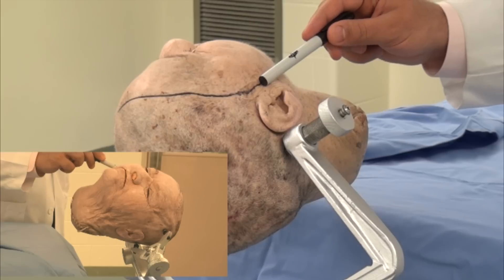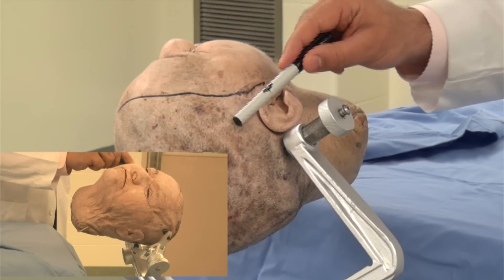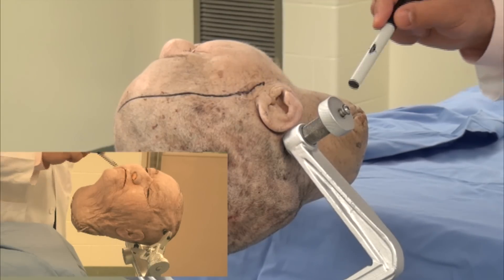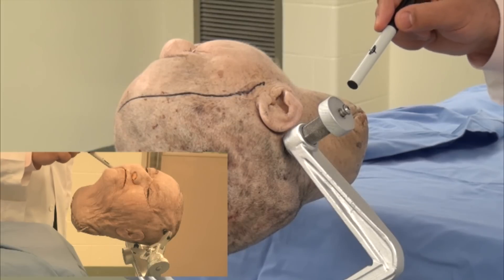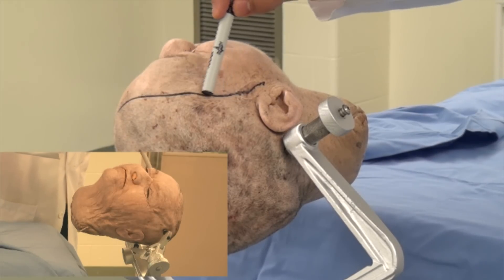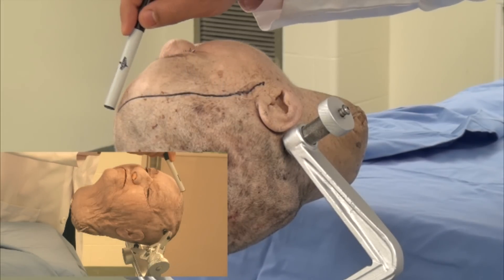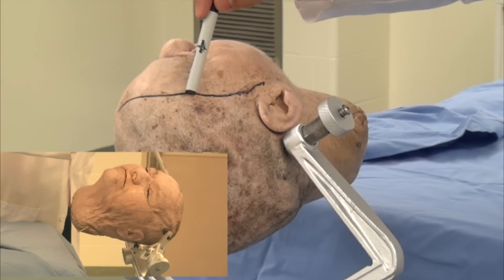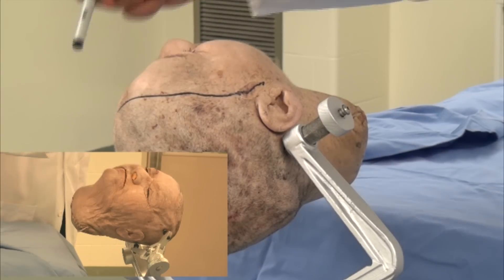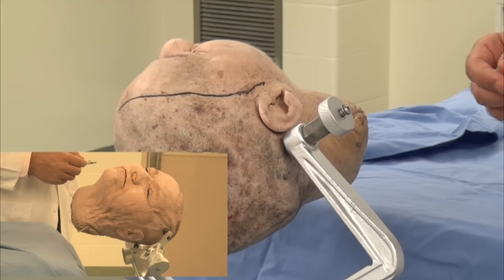The incision is extended superiorly, perpendicular to the superior temporal line, which is the attachment of the temporalis muscle. After that, it's continued right behind the hairline all the way to the mid-pupillary line contralaterally.